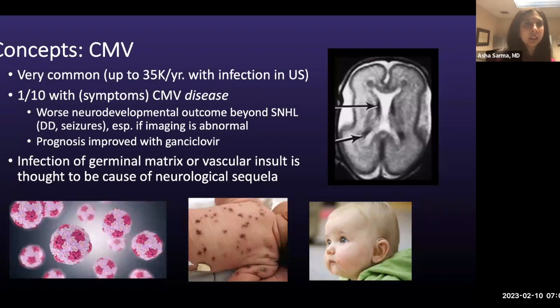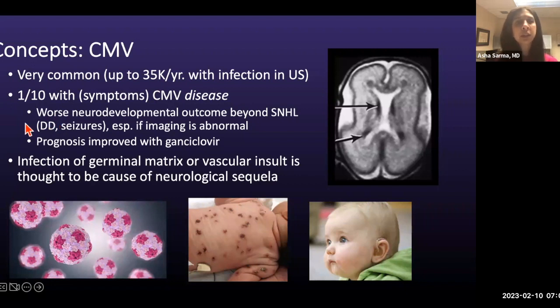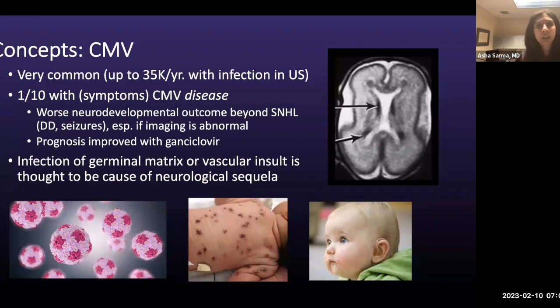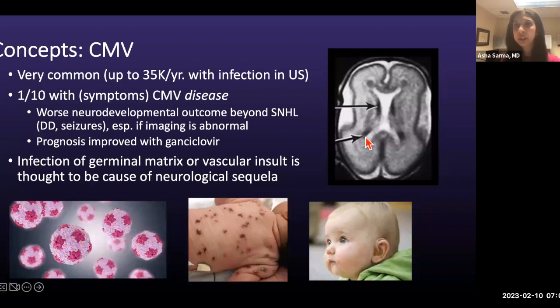CMV is very common — up to 35,000 patients a year are infected in the US. Only about 10% present with CMV disease, a symptomatic manifestation. Patients with CMV disease have worse neurodevelopmental outcomes beyond sensory neural hearing loss, such as developmental delay or seizures, especially if imaging findings are abnormal. Prognosis can be improved with gancyclovir. The brain manifestations are thought to result from infection of the germinal matrix or vascular insult.